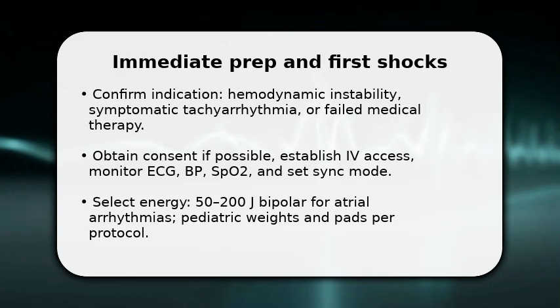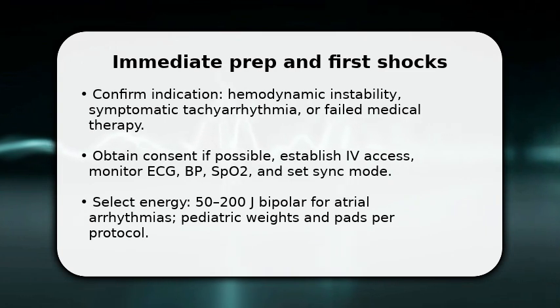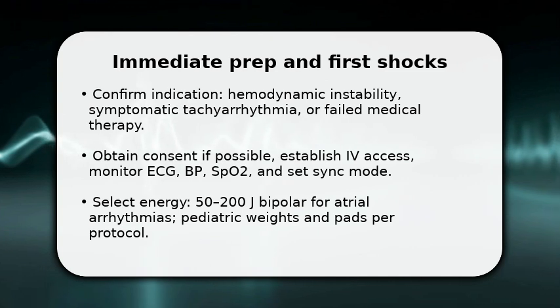Enjoy the video. You start now, confirm the indication and explain urgency to the team because seconds matter. Place pads in anterior lateral or anterior posterior positions and connect monitoring leads. Make sure the defibrillator is in synchronized mode. Once done, verify sedation plan and titrate analgesia or anesthesia.